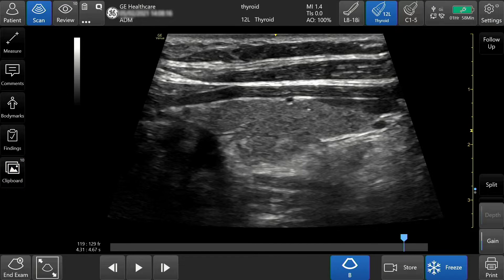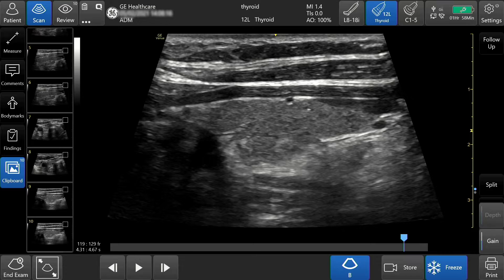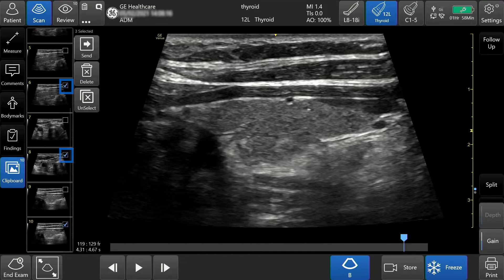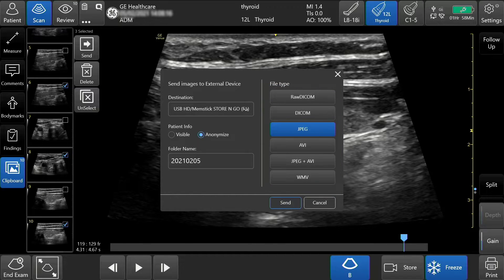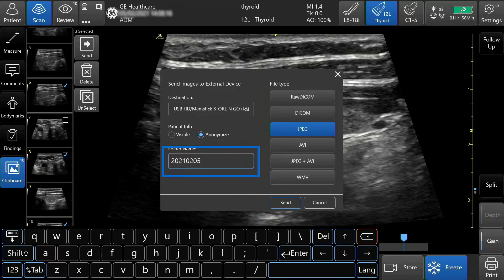To send images individually to an external device while in an active exam, tap Clipboard. Select the desired images, then tap Send. If desired, you can anonymize your patient here. Select Raw DICOM to send images with raw data — this allows you to manipulate the images, such as when re-importing them back onto the system. Select DICOM to send images to an external device such as a DICOM viewer, PACS, or to transfer images back to the system for viewing. Select JPEG, AVI, or both, or WMV for easy transfer onto a computer. You can name your folder, then tap Send.